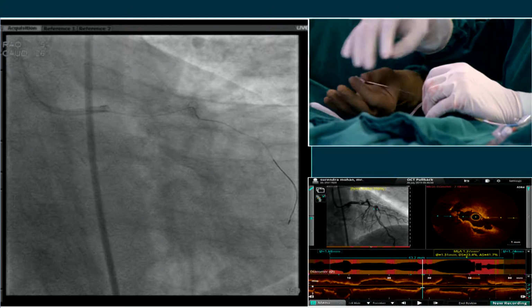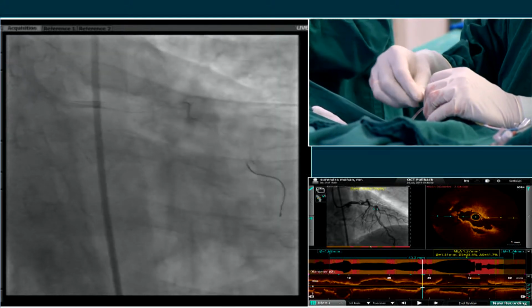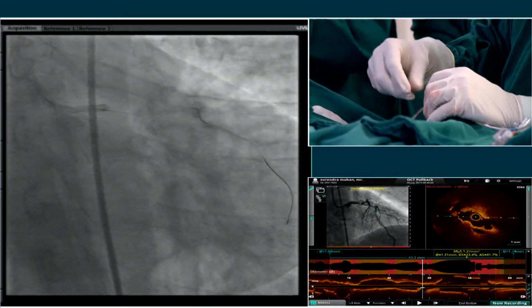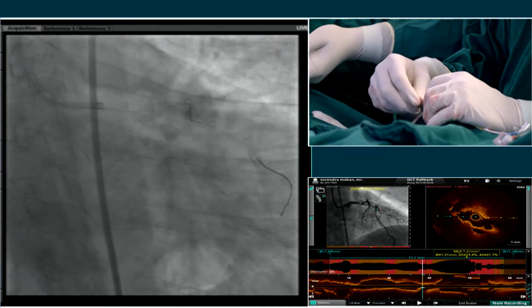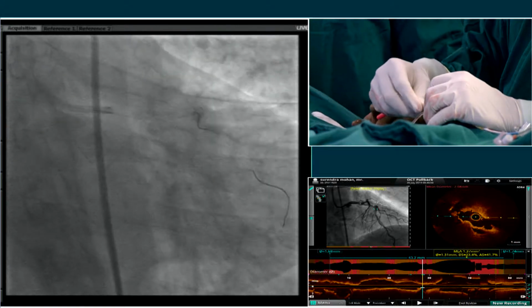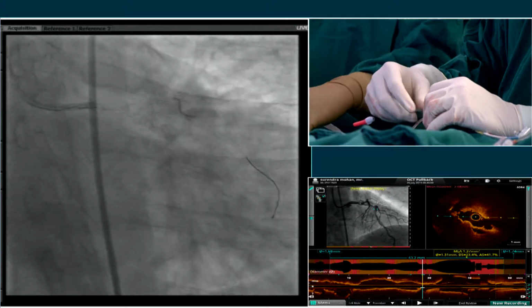I'll do it that way because if the patient gets unstable and you need to stent quickly with 2 stents, then you can put them both in at the same time through a 7 French, whereas a 6 is very challenging. Yes, 6 will be difficult because we are taking 3.5, size of the left main is 4, we have to do a POT with 4, so 3 point.